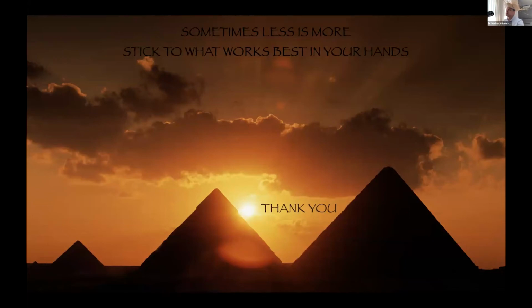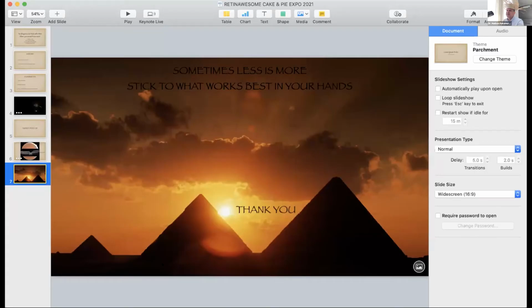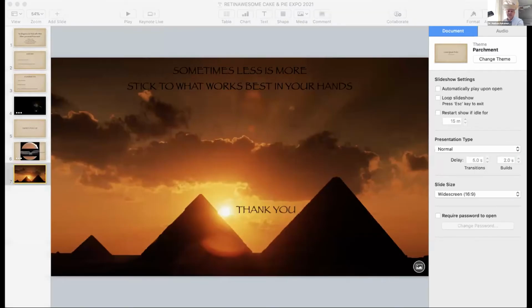Congratulations, Vaibhav. And you see that you left the very foveal center untouched, and the OCT image is pretty cool. So you did a very great job. And sometimes we get those hemorrhages. And as I tell the residents and fellows, you've got to be very careful when you use a 23. I prefer to use the 25G backflush cannula to actually remove those tiny little hemorrhages that get around sometimes when you peel the ILM. But fortunately, they were far from the foveal area, and you did a very cool job.